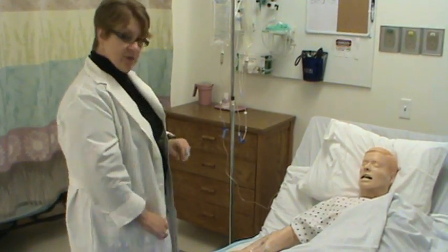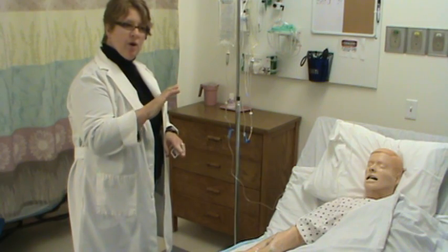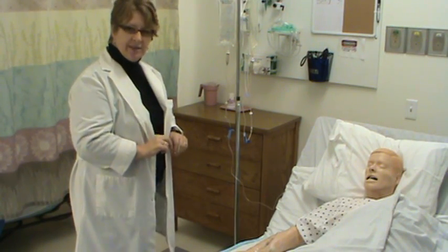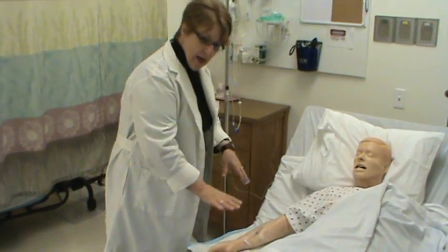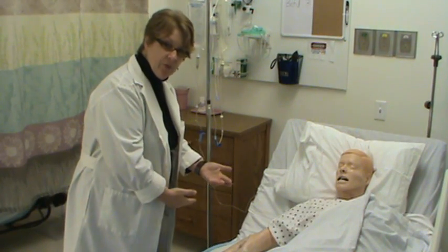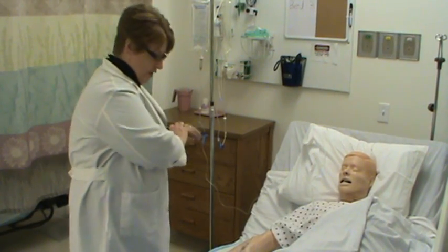For the purposes of the students who are watching, I want to just remind you that we've already done all the things we need to do in the med room. We've spiked our primary bag, we've spiked our secondary bag, we've primed them, we've demonstrated that we know how to set the drip rates, and now we're here with the patient. What we would do is carry our system into the patient's room. However, because the mannequins cannot have fluid running into them, we're illustrating with dummy bags over here.